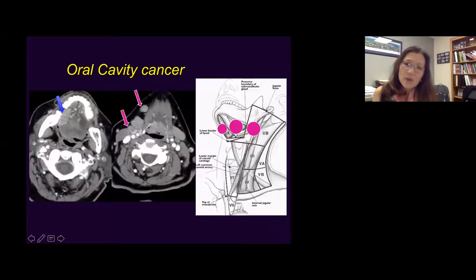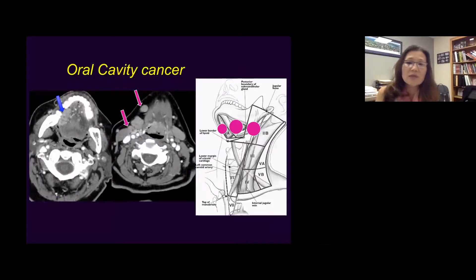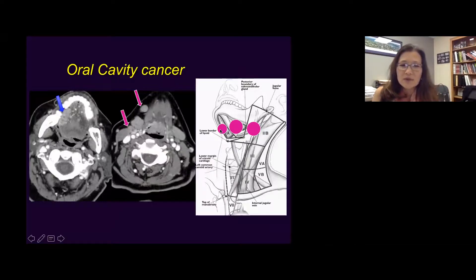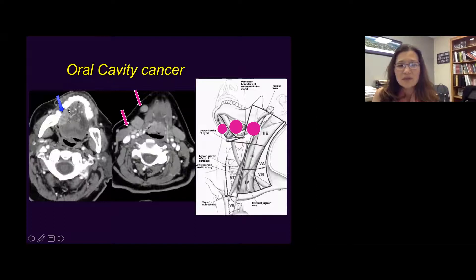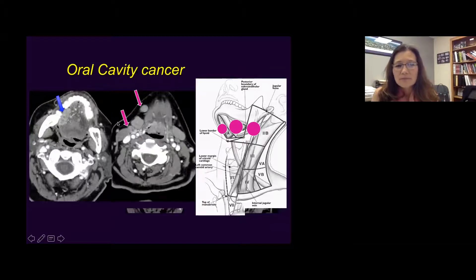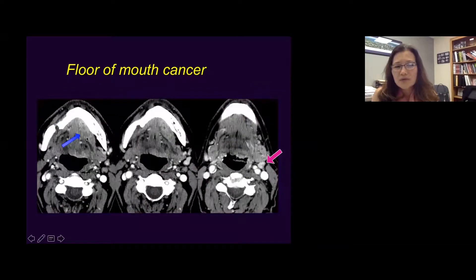When dealing with oral cavity cancer, such as tongue cancer or alveolar ridge carcinoma, these tend to metastasize to more anterior zones — level 1A, 1B, or level 2. This is a great example of oral cavity tongue cancer metastasized to a level 1B node. This is another floor of mouth carcinoma — notice the ill-defined enhancing mass in the floor of mouth on the left side, and a metastatic lymph node at level 2.